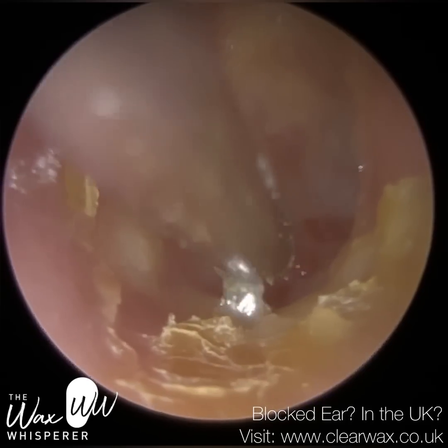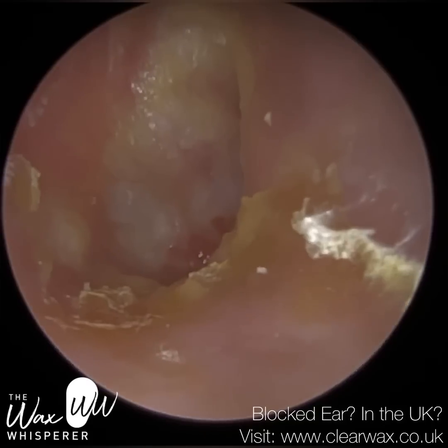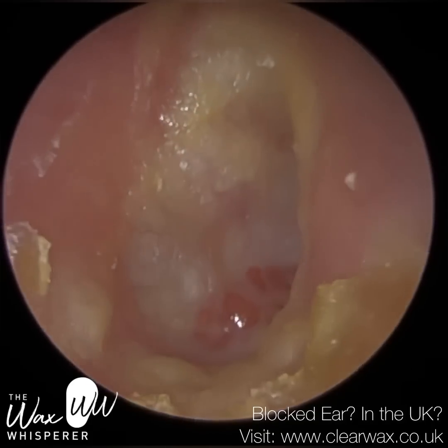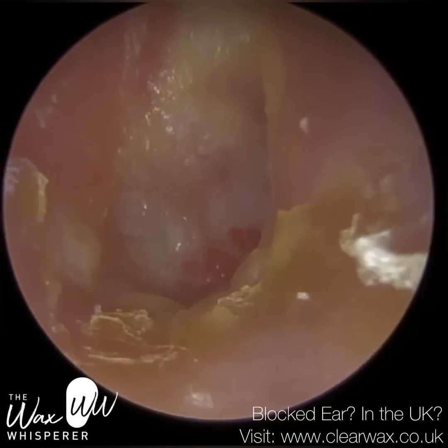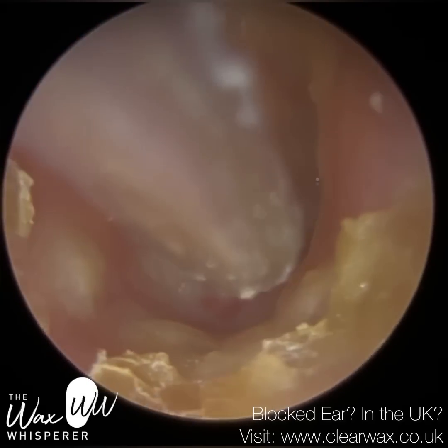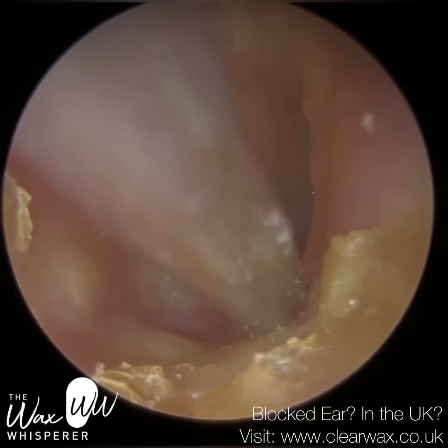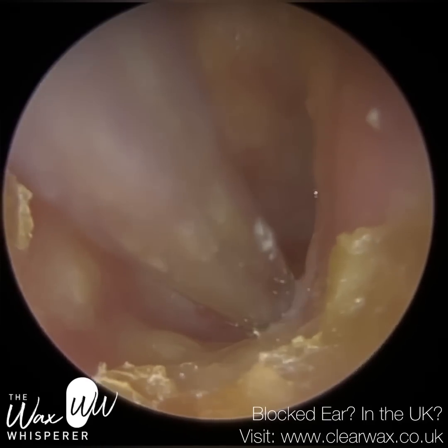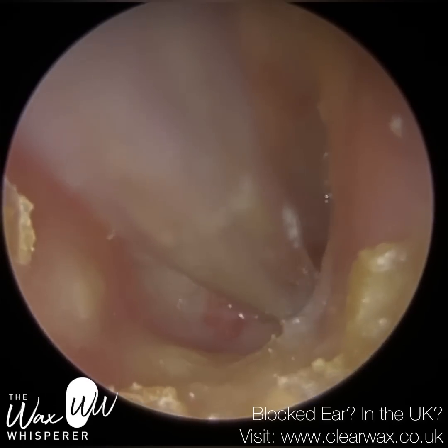Now, we're not going to get every little aspect, guys. There's always going to be bits and bobs here, but I'm going to try and remove as much as possible. At the base, it is quite adhered, so it's quite tricky. But already you can see the difference between this patient's ear upon attending and at this halfway stage, or even less than that, a third of the stage. So we are going to just spend a bit more time mopping up.